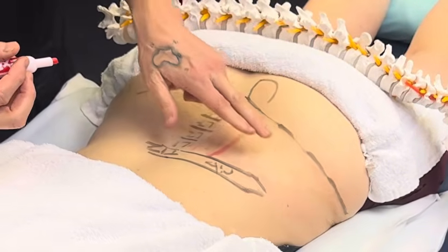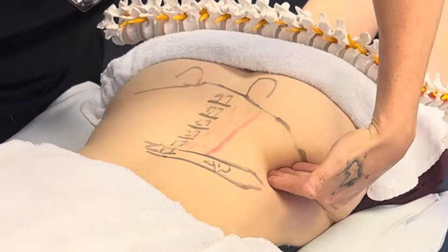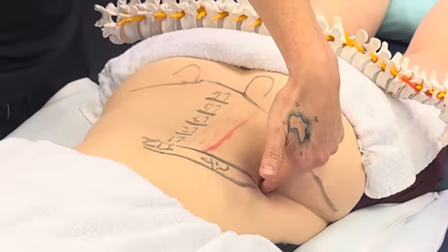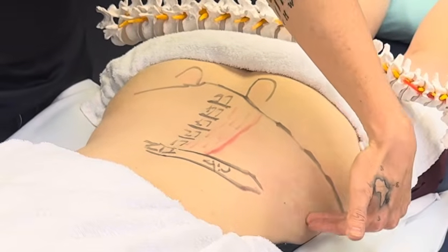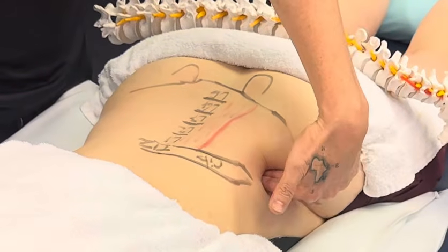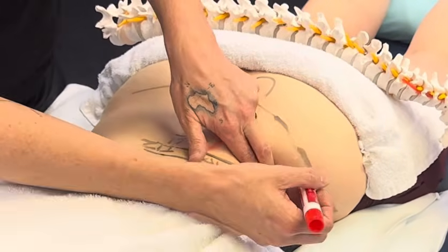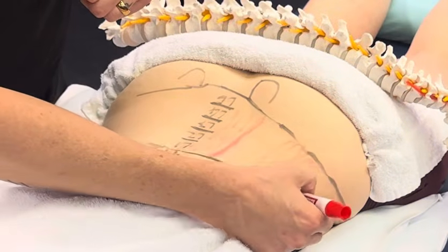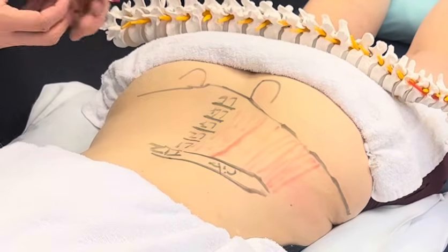To find it, if you'll wrap your fingers around, just like we always do, from the side, we can come, there's muscle right there. And it's gonna be deeper than what you would think, okay? There it is, it's right there. I'm on the front of that muscle. If I go too far forward, there's nothing, okay? So this is one where you can clearly feel muscle there, okay? And again, this is a two-dimensional drawing of a three-dimensional object, but it's there.